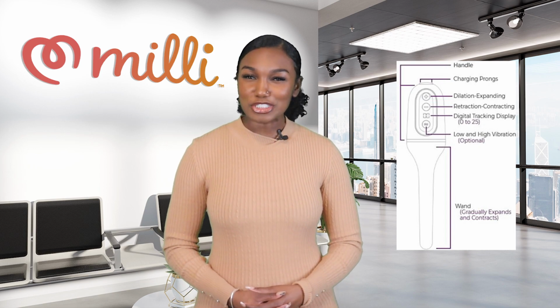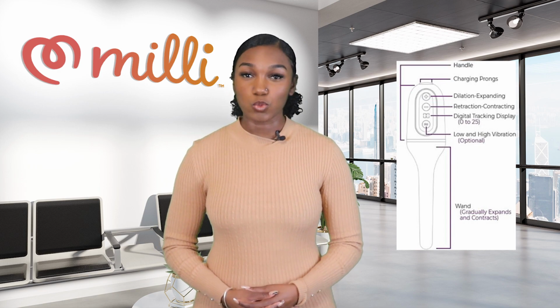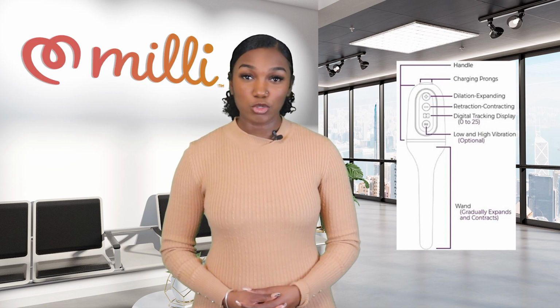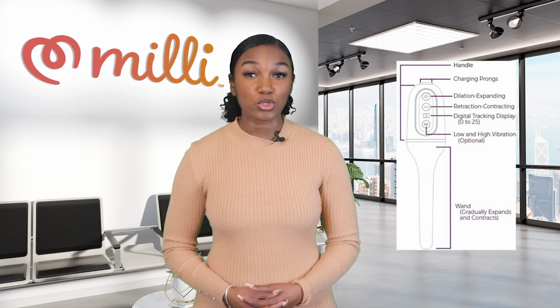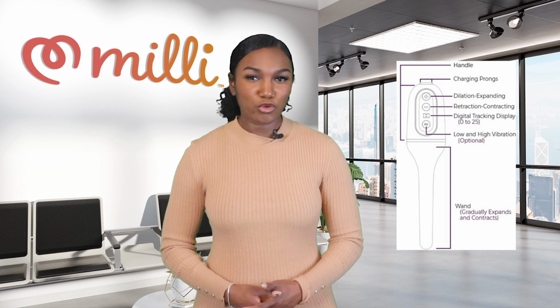The next button looks like two wavy lines, and this is for the vibration feature. When you press this once, you will feel a low vibration. When you press it again, you will feel a stronger vibration. And when you press it a third time, the vibration will turn off. Using the vibration feature is optional, so don't feel like you must use it during your treatment if you don't find it comfortable.